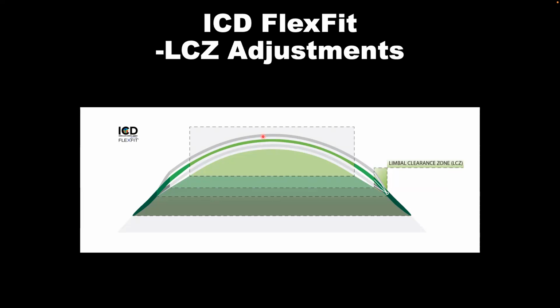Langis Michaud did a study showing that a good fit was between 200 and 400 post settling. So I feel comfortable with that. I know Maria Walker, an ex-president of the SLS, the Scleral Lens Society, feels comfortable with 150 microns after settling, so that's okay with her.